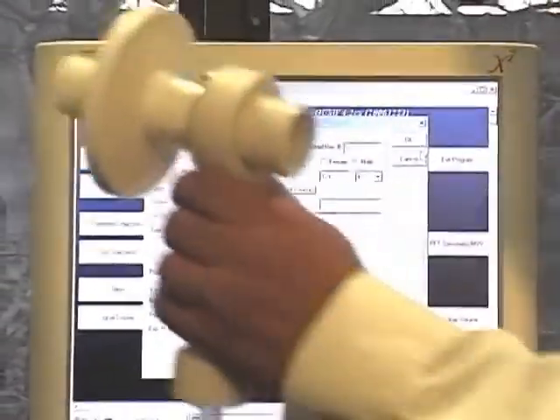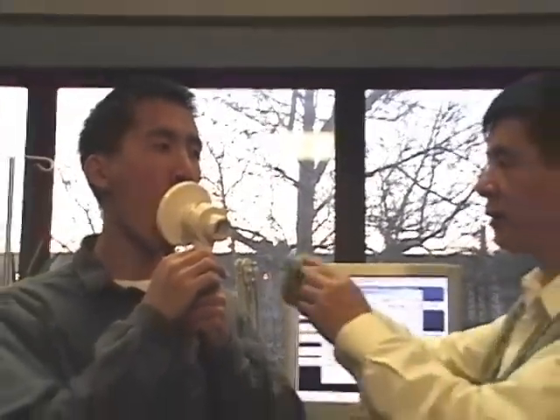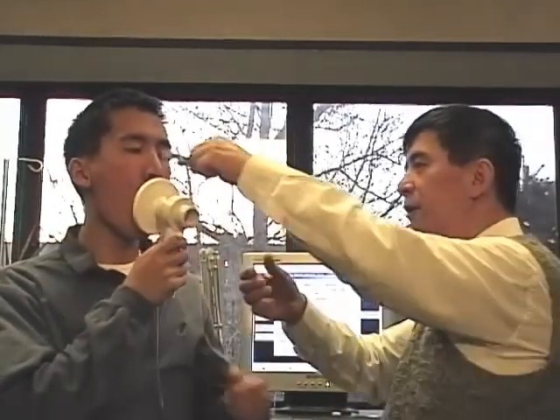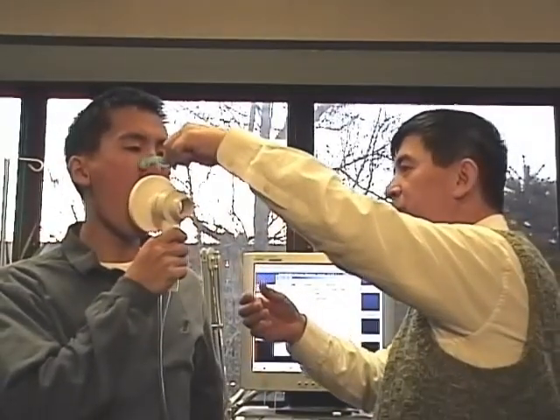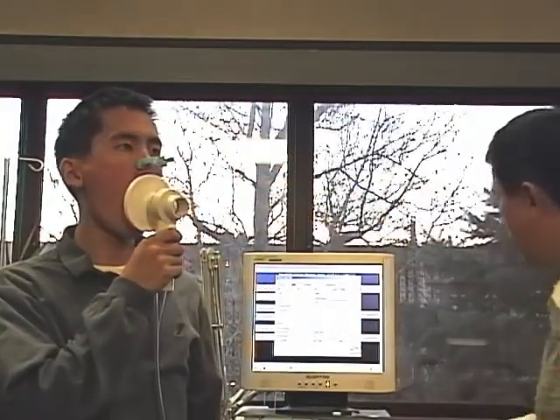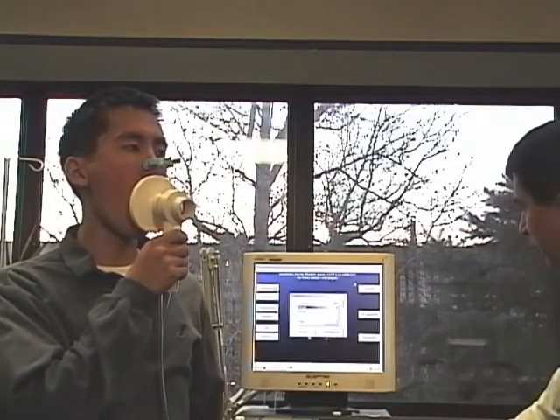You have the subject put the mouthpiece in. Click the nose clip and click OK.